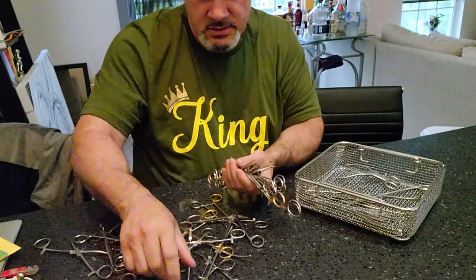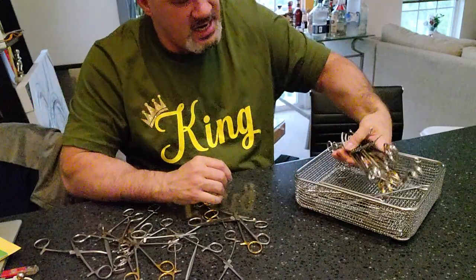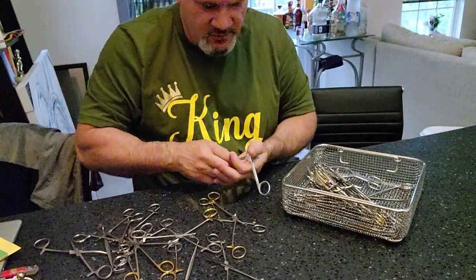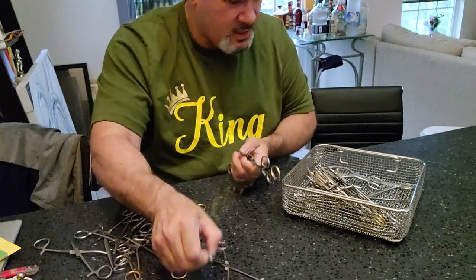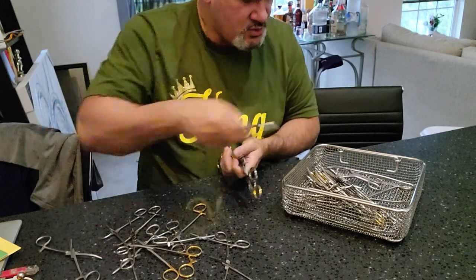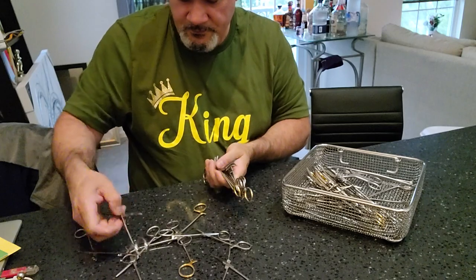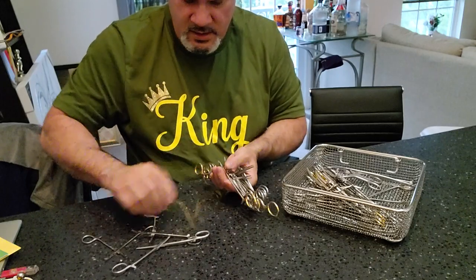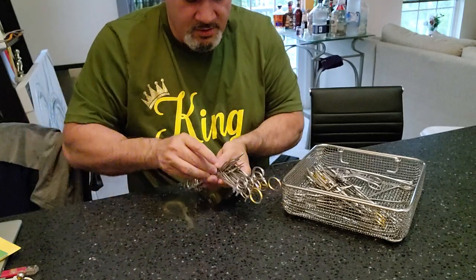We are opening all our instruments, all nice and butterflied. This is the way all instruments should be sent back. Any retractors have the instruments in the bottom. All instruments face in the same way to protect them. We've got our instruments all opened up and butterflied.